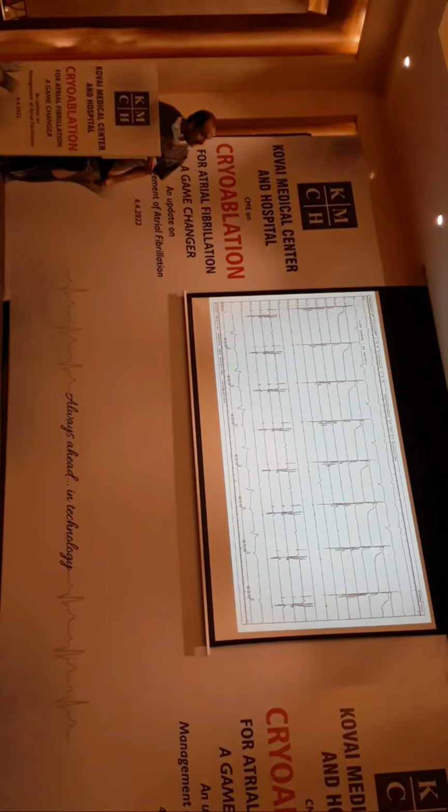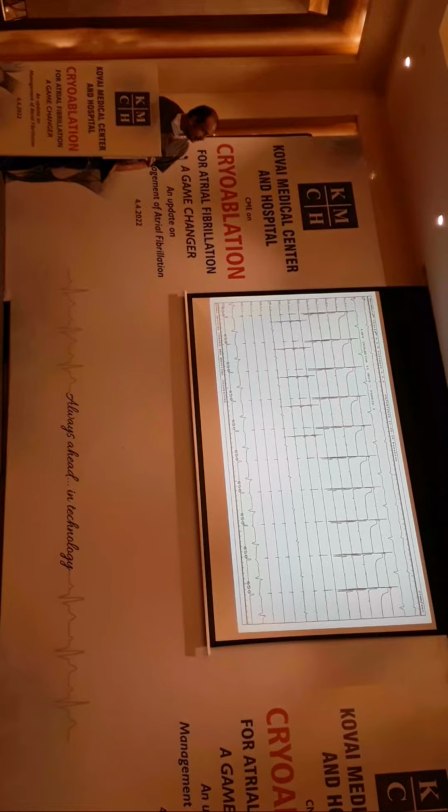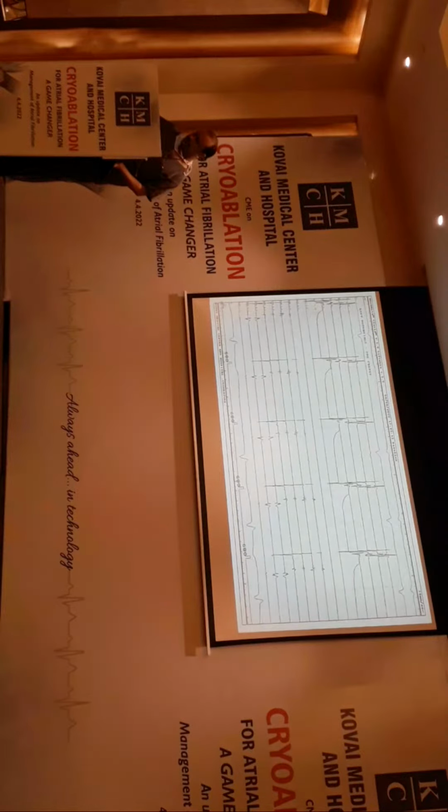The same way we went into the left inferior pulmonary vein, we are trying to isolate. You can again clearly see spiky pulmonary vein potentials here. But in spite of the freeze, the first freeze was not working, so we have to readjust the balloon. So we have gone for a second freeze here. You can see a spiky potential here, spiky potential here. Suddenly when you reach here, you no longer see a spiky potential following your atrial potential. So this LIPV also got isolated with the freeze.